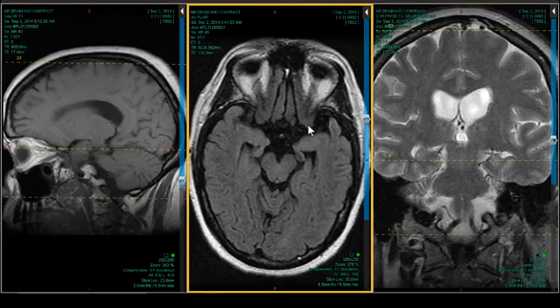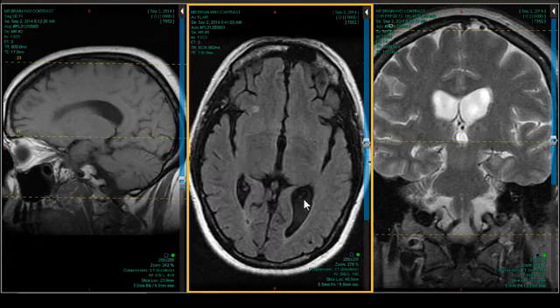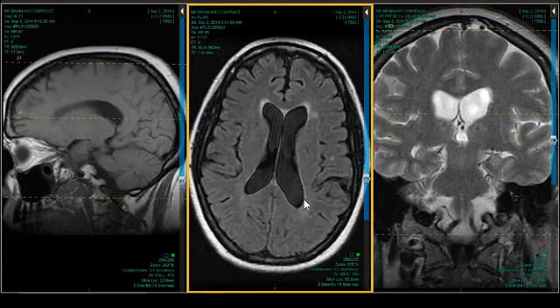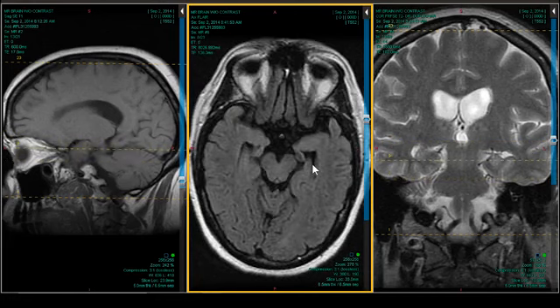There is a subset of ALZ with neurofibrillary tangles, tau bodies, and amyloid plaques that occurs in the occipital region. Somebody asked me about it at a course in New York. It was given some guy's name who described it, Benson syndrome, but it really is identical to ALZ. It just happens to start in the back of the brain, and they often present with visual symptoms first, which is kind of weird and throws you off. So this is some variation of one of the semantic syndromes, probably a subset of Pick's disease.